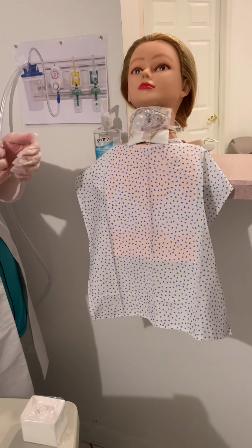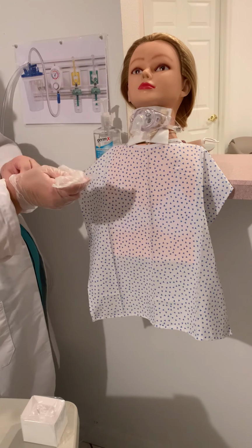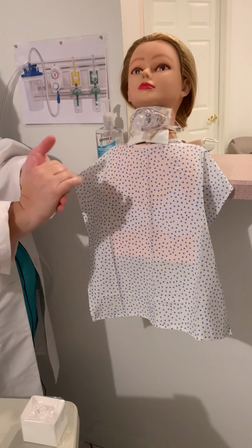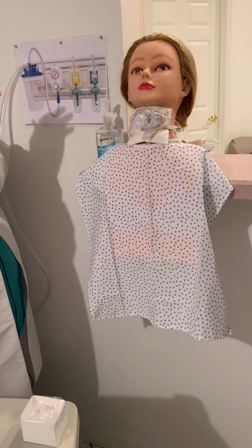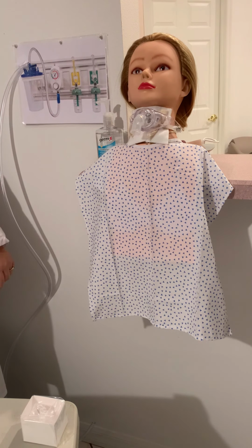Mrs. Harper, is there anything else I can do for you today? If not, here is your call light. Call me if you need anything before I come back to check on you. We'll take our gloves off. We'll wash our hands. And then either before we leave the room or after we leave the room, we're going to go ahead and chart. We are going to chart the color of the secretions, the amount of the secretions, consistency of the secretions, odor of the secretions, and how the patient tolerated the procedure.